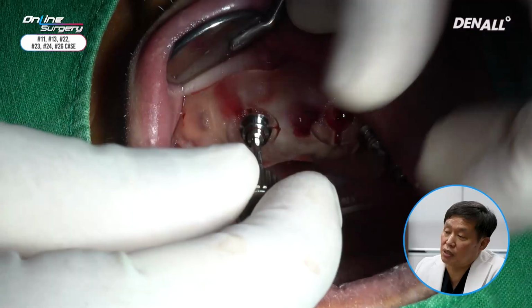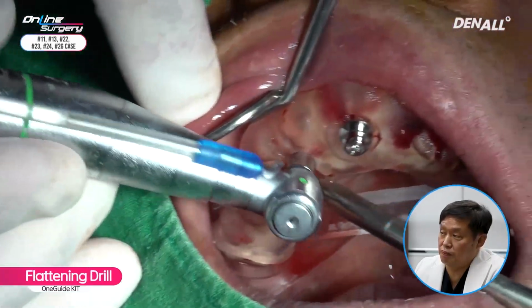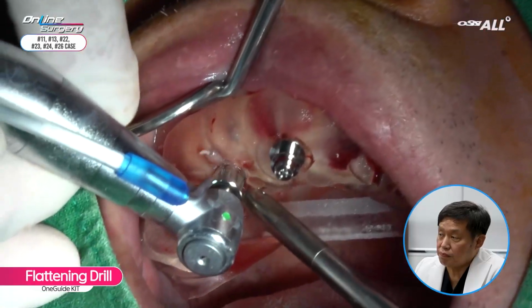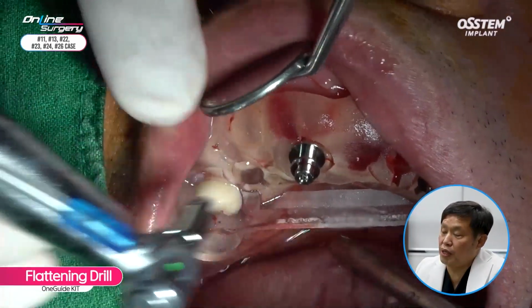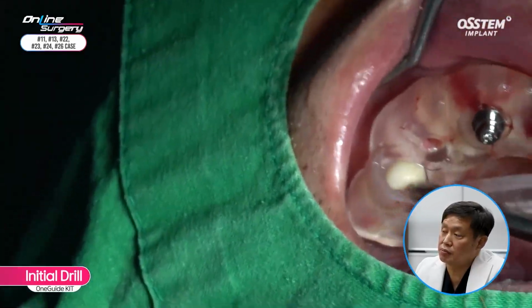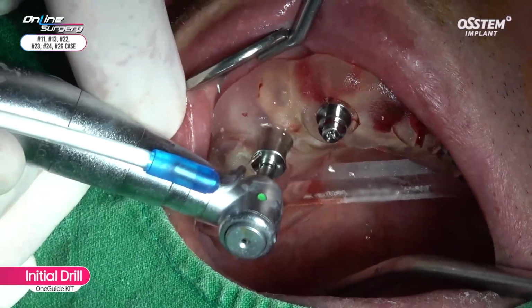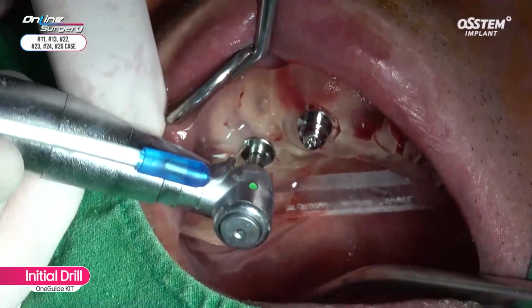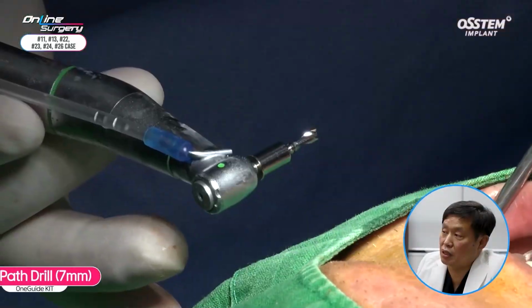Now moving on to number 13, flattening drilling was done. Full-length flattening drilling was done, followed by initial drilling in number 13. This was the canine area.